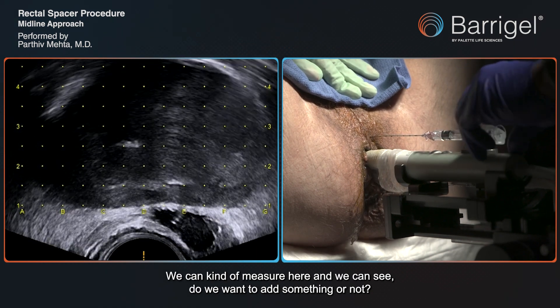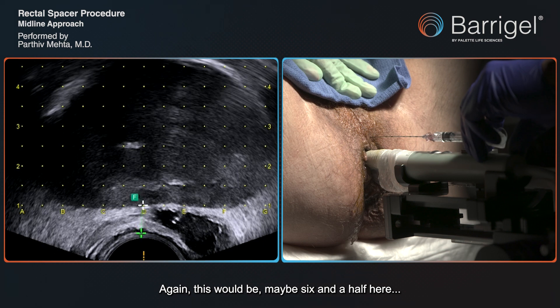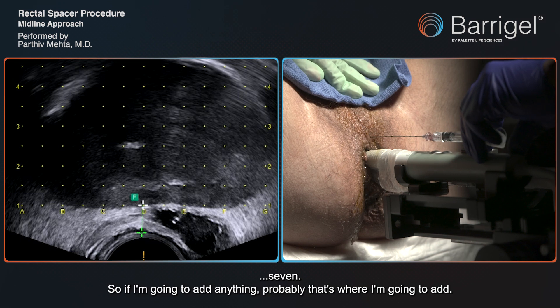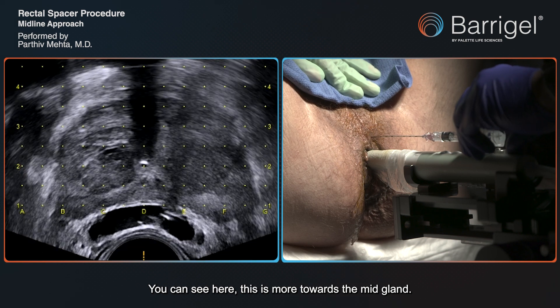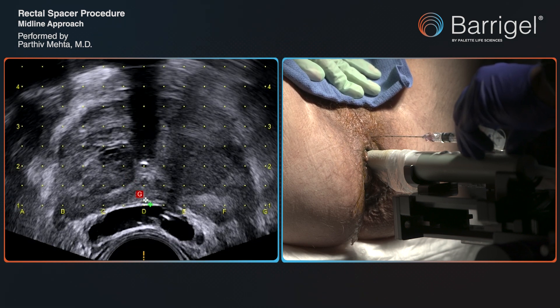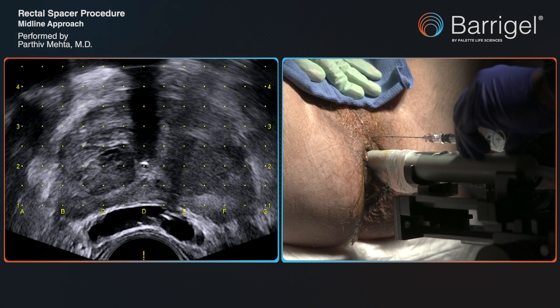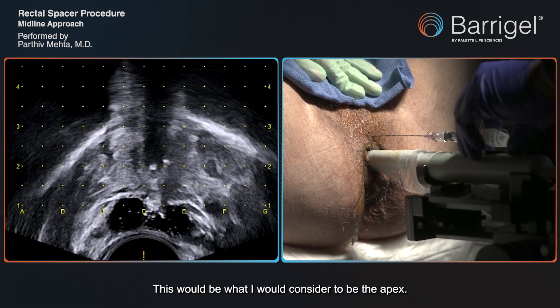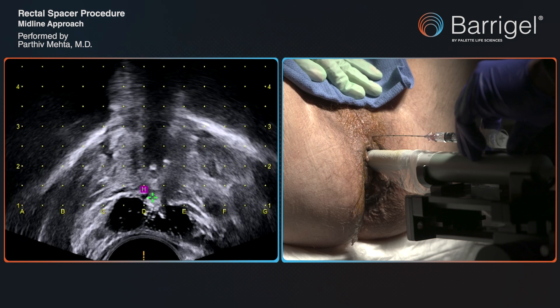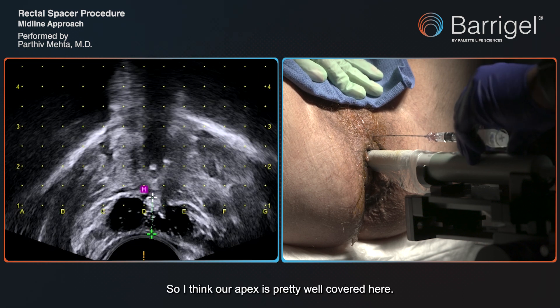We can kind of measure here and see if we want to add something. This is at the base of the prostate — maybe six and a half to seven millimeters there, so if I'm going to add anything, that's probably where. Looking at this, more towards the mid-gland is about seven millimeters. Moving further, more like seven and a half, and then nine and a half at what I would consider to be the apex. So our apex is pretty well covered.